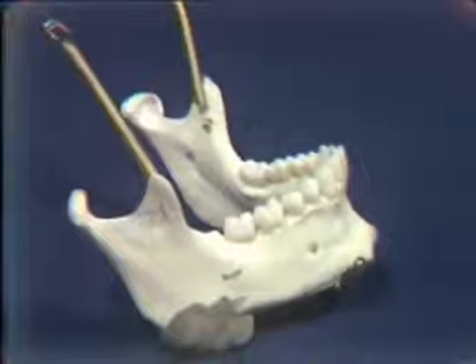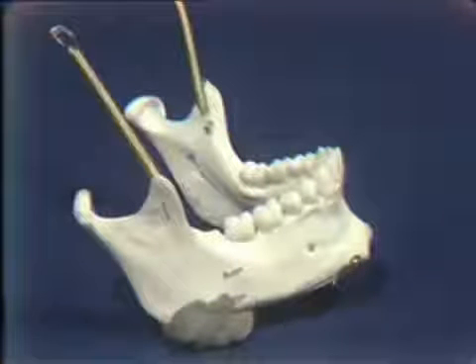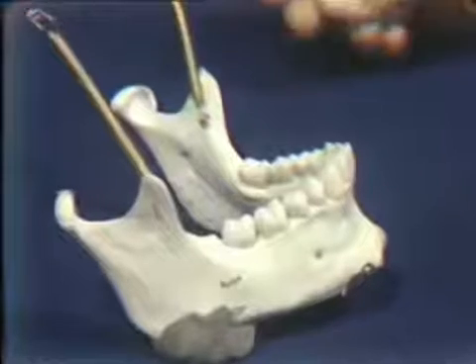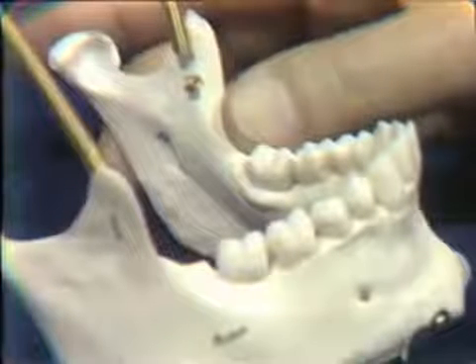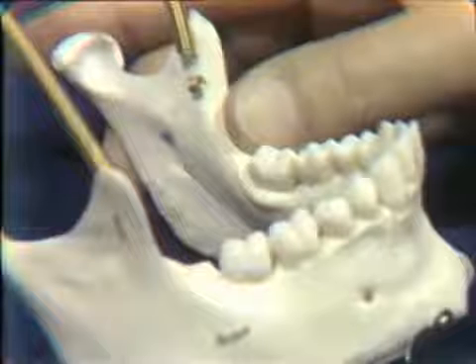Let us recall our landmarks for the inferior alveolar and lingual nerve block. To get our needle bevel to the mandibular foramen, we utilize, as you recall, the anterior and posterior borders of the ascending ramus. We have the patient open as widely as they can, and then we come in with our thumb of that hand and palpate and find the greatest depth of the concavity of the anterior border of the ascending ramus.